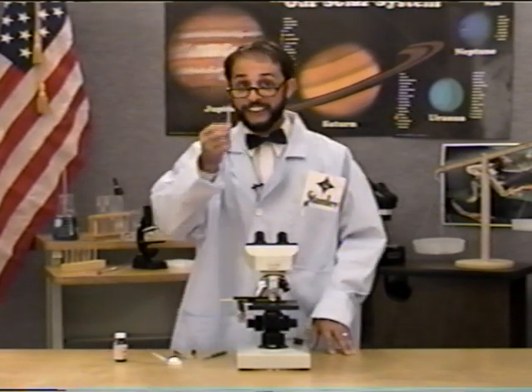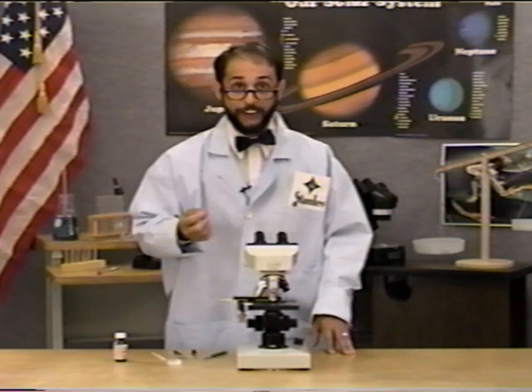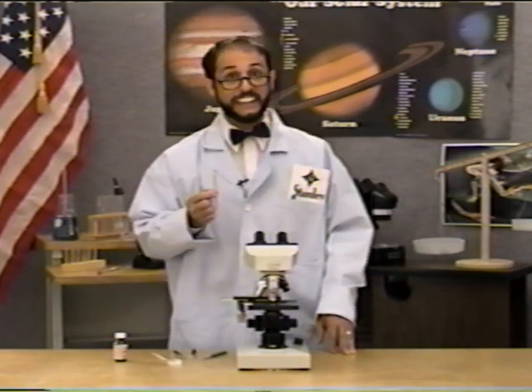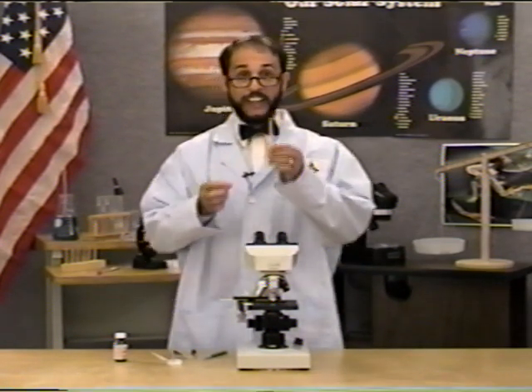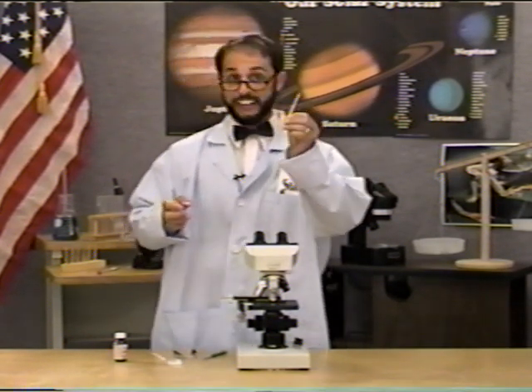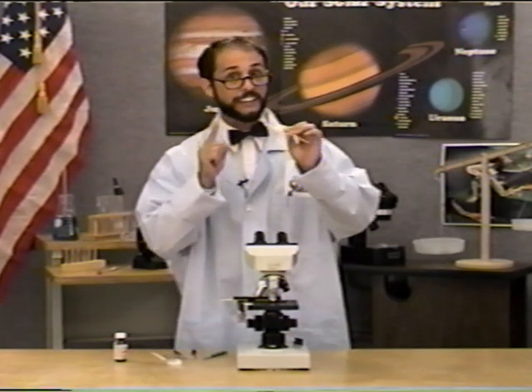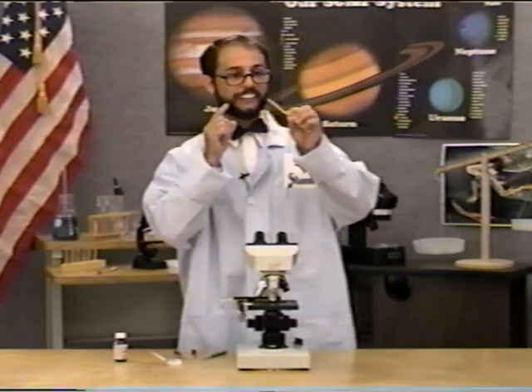Another type of human cell that is fairly easy to collect and observe is a human cheek cell. To collect such a sample, you'll need a blunt object such as this tongue depressor, and you'll need to open your mouth and scrape the soft inner lining of your cheek this way.